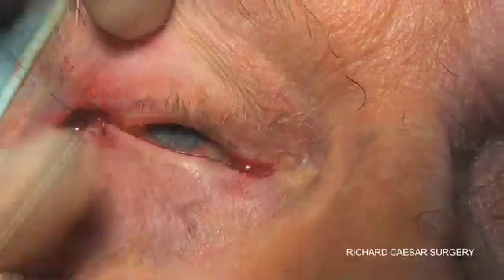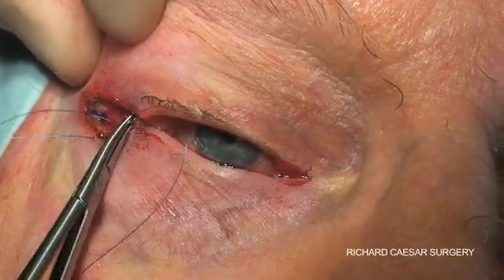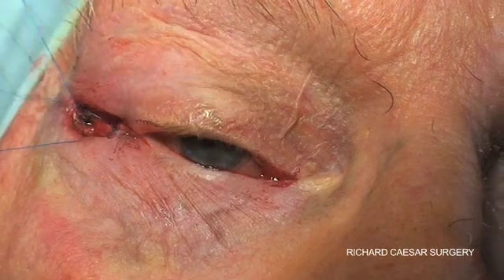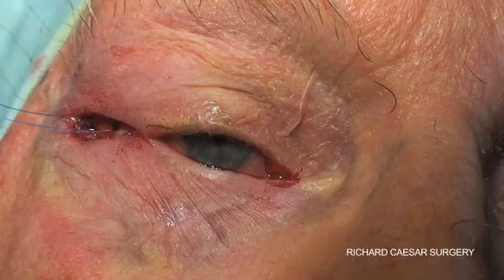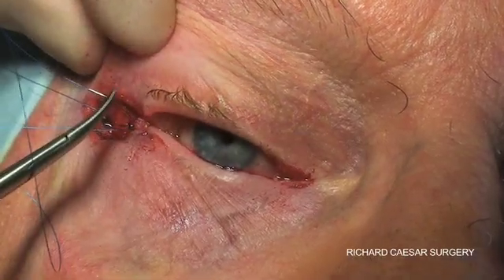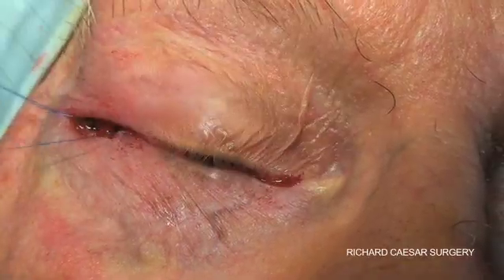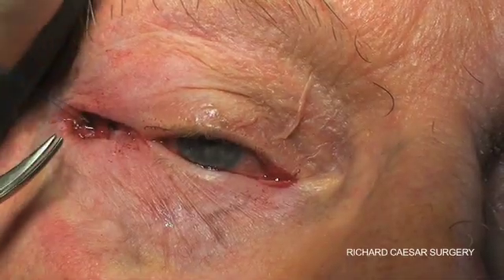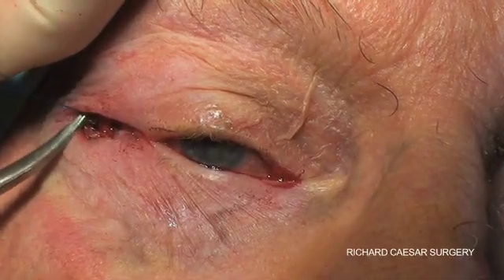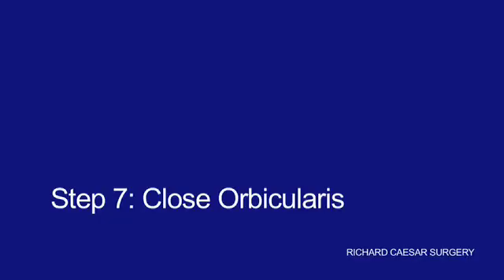While it's a little bit more difficult to place the knots with the needles in place, each proline needle can then be passed posteriorly through the soft tissue and then trimmed at the exit point. This makes the burying of the proline effortless, which makes the patient significantly more comfortable, as a sharp pointed end of the proline sticking upwards can be very unpleasant.